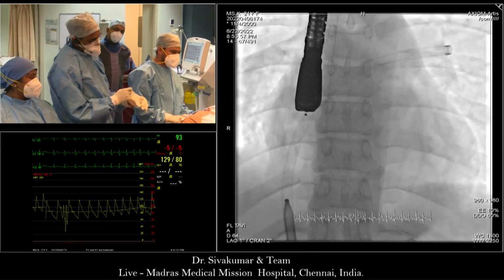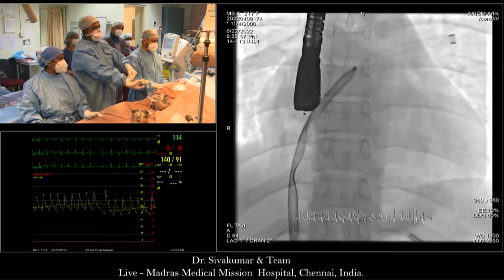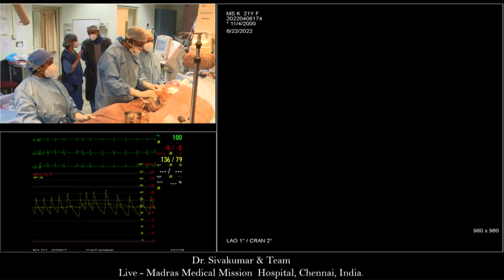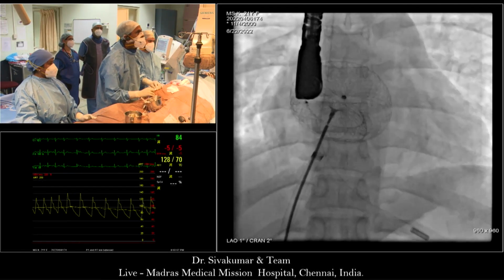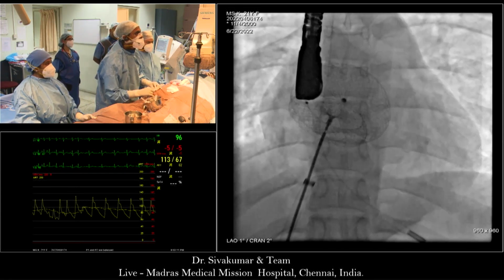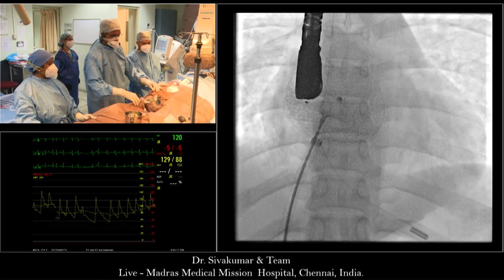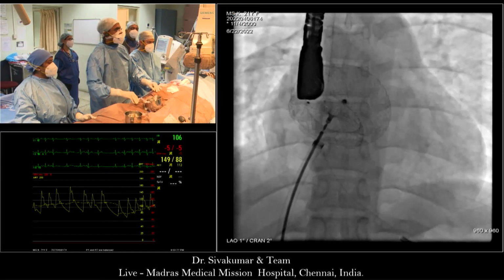So I experienced a case during my initial experience in which mitral valve encroachment was observed, but we finished the procedure and the patient developed mitral valve erosion, but she didn't want surgery. As time went by, the mitral regurgitation disappeared. It fibrosed up. How did that happen? Did it heal itself? I don't know. I will show you the device next time.